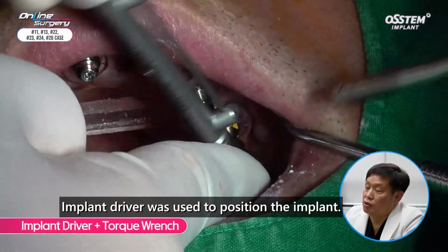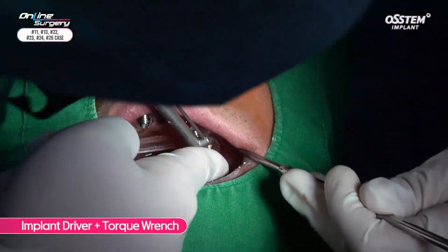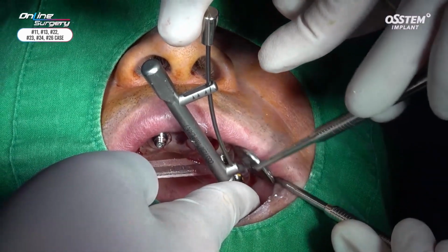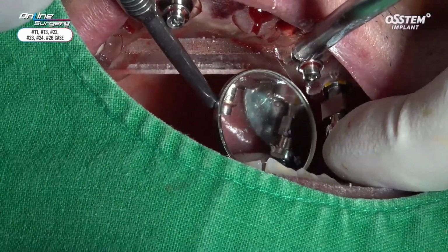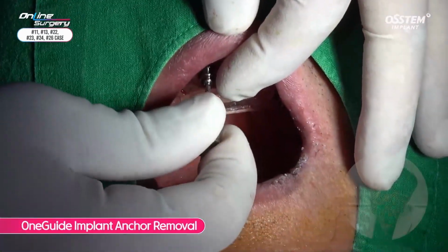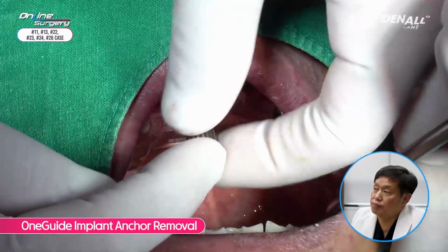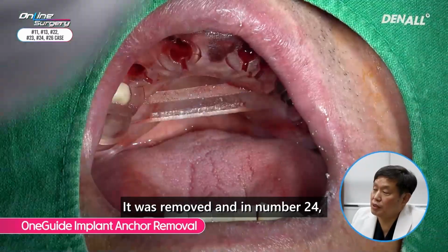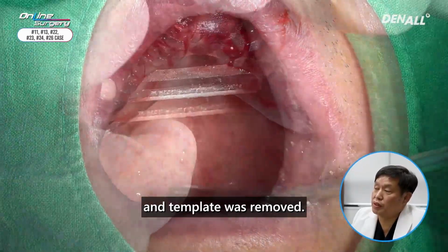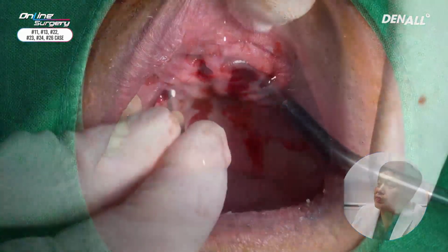Implant driver was used to position the implant. In number 11, where the implant anchor was, it was removed, and in number 24, implant anchor was removed and template was removed. The implant placements were complete.